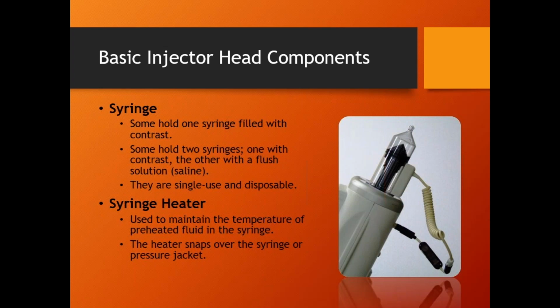I know you guys said you don't have a whole lot of experience with this. Guess how much this costs? This little piece of plastic, there's just a little resistor in here. The current makes these little things here. $150? Nope. Nope, higher. More than $999. $1,300. $1,300 for this, and you can't fix it.